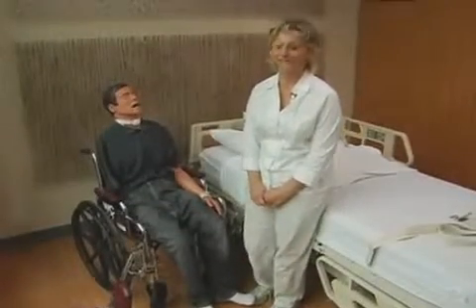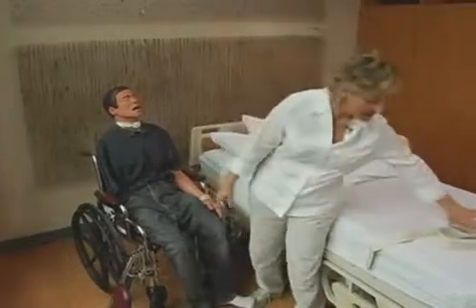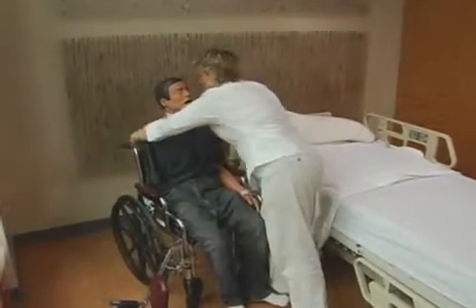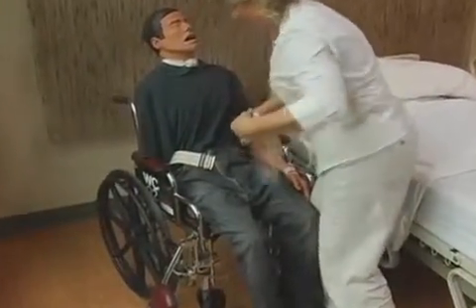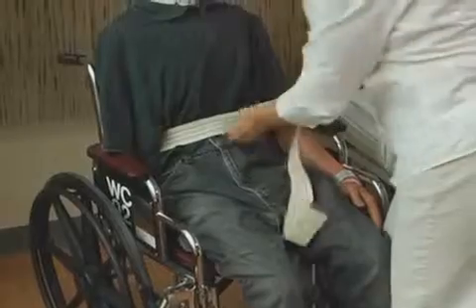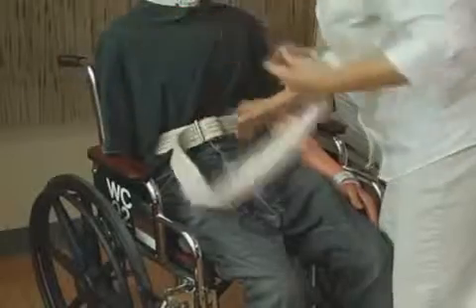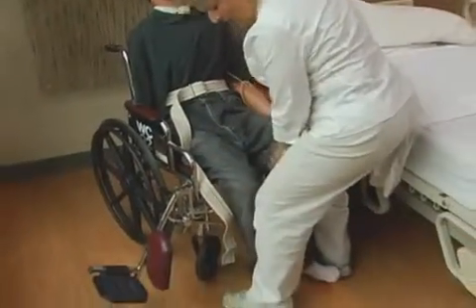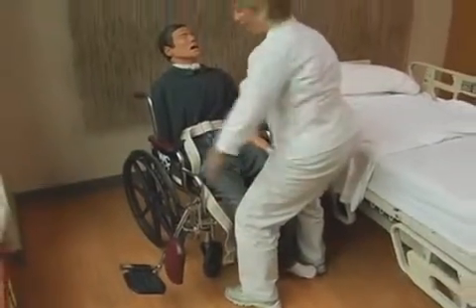Okay, now it's time to put Victor back to bed. We've brought him into his bedroom and have him right here beside his bed. We've got to put our gait belt back on. Just have him lean forward slightly. Wrap the belt around his back and around his waist, or at waist level. Feed the gait belt through the teeth first, and then the open end. Same thing as earlier. Get your legs on each side so you can guide his feet when you stand up. Be sure to bend from your knees, not your back.